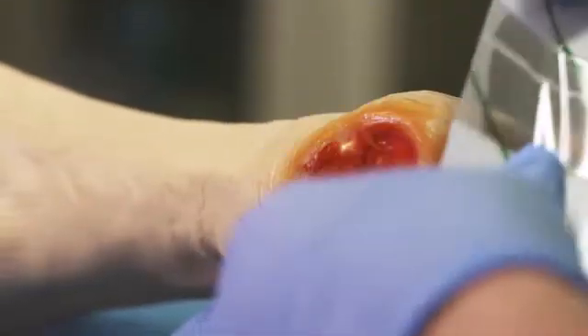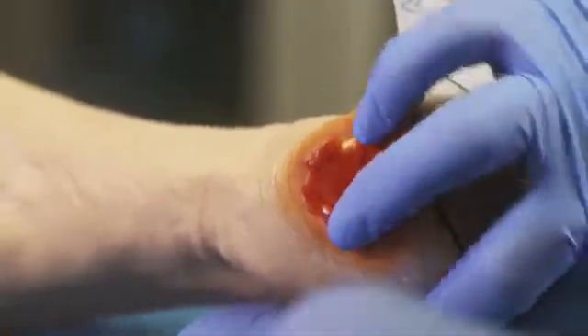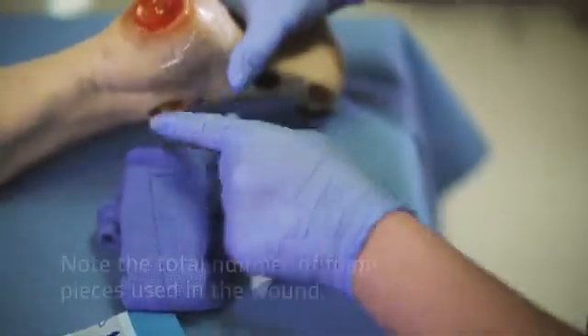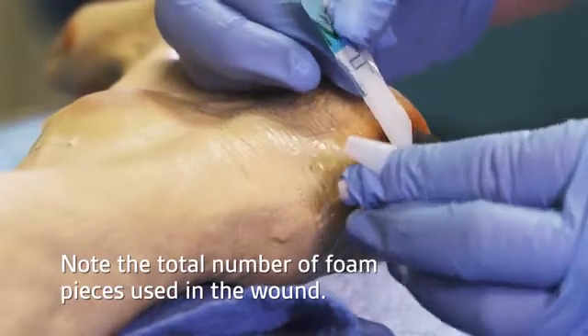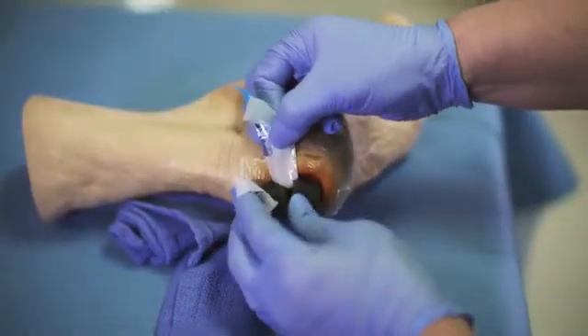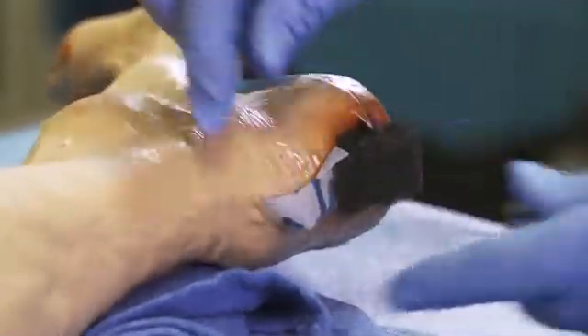You may want to place the VAC drape and use the picture frame technique around the entire peri-wound area to minimize the exposure to intact skin. Gently place the VAC granule foam dressing into the wound. Then cut one thin strip of VAC drape to secure the VAC granule foam. This will hold the foam into place while you address the bridge dressing on the anterior portion of the foot.